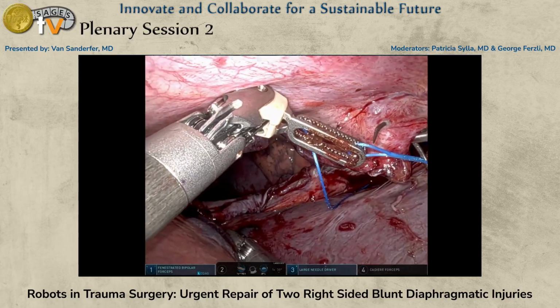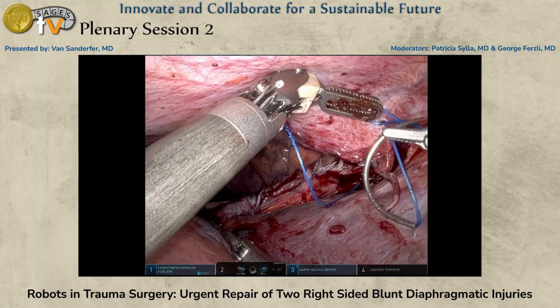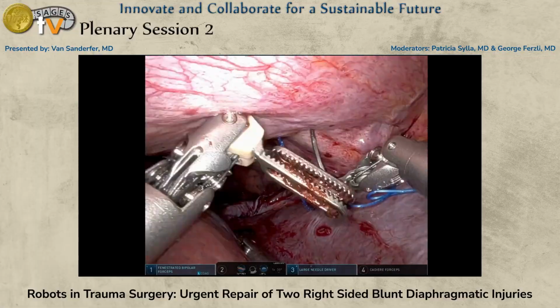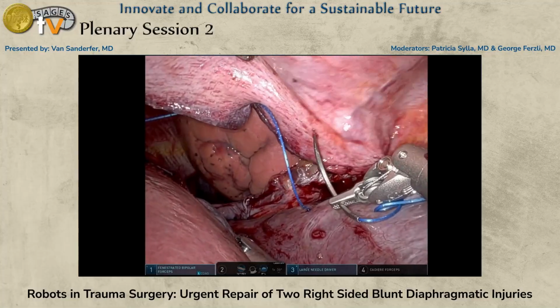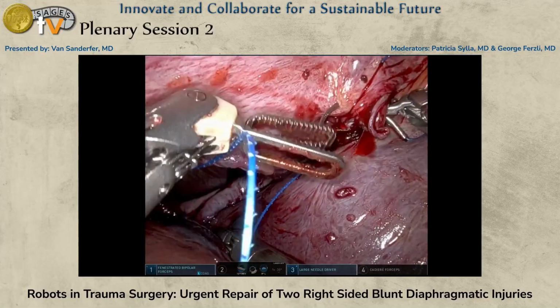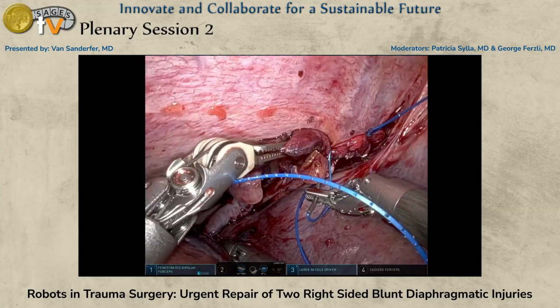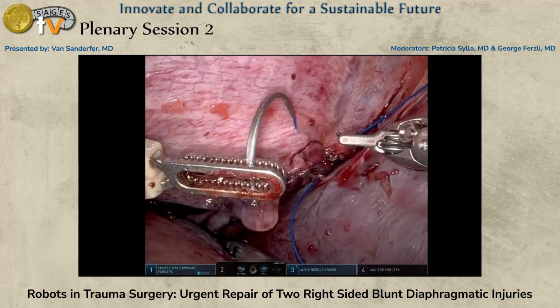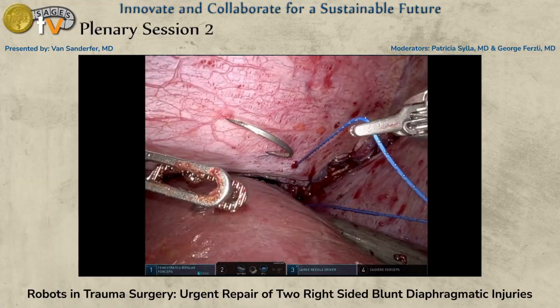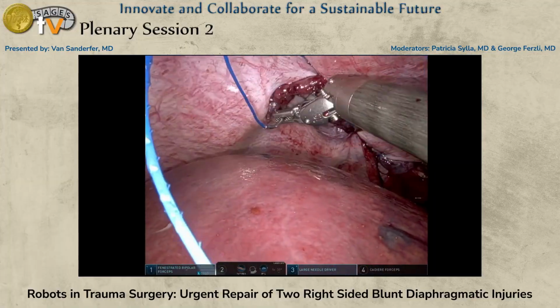We began our repair from the medial aspect of the injury, and at our facility, we only had the choice between a 6-inch and an 18-inch barbed suture. And given our defect size, we elected to use the longer suture, however, had significant difficulties given the length and the space that we were working in. So in the future, we would recommend using a shorter suture length, either a 12-inch or a 9-inch, or really whatever would fit your defect size.